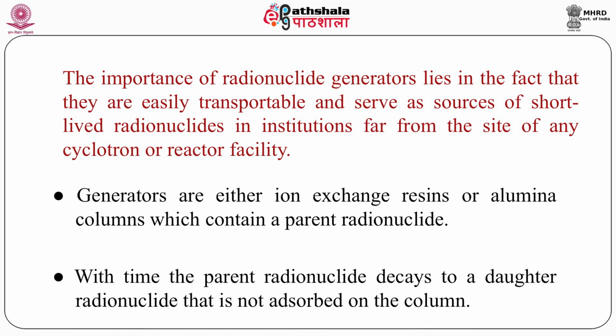The importance of radionuclide generators lies in the fact that they are easily transportable and serve as a source of short-lived radionuclides in institutions far from the site of any cyclotron or reactor facility. As we have seen, generators are there. This is not the only generator we are talking about, molybdenum-technetium. There are other generators like germanium, gallium, strontium and yttrium that we are going to talk about in a few other slides.